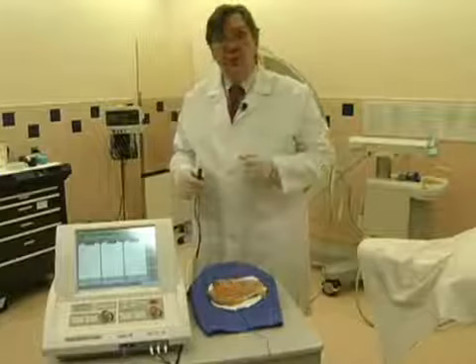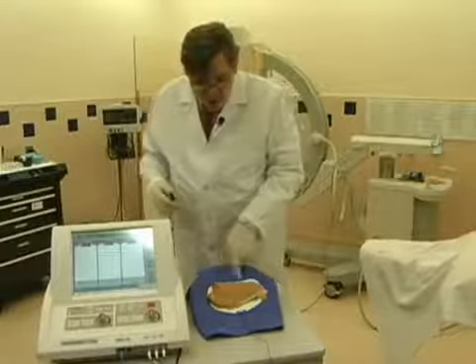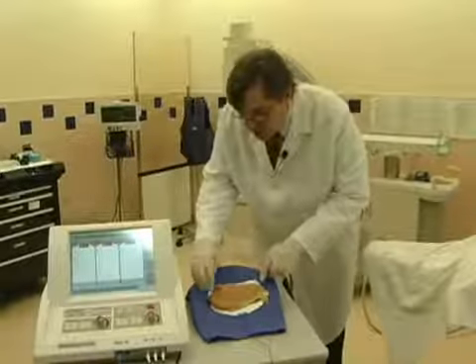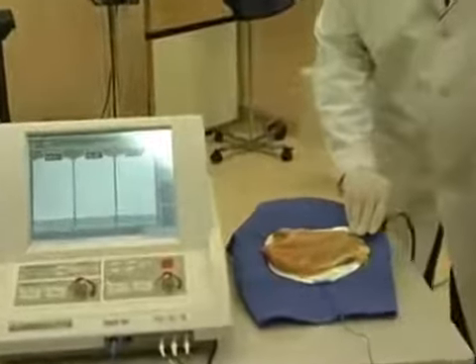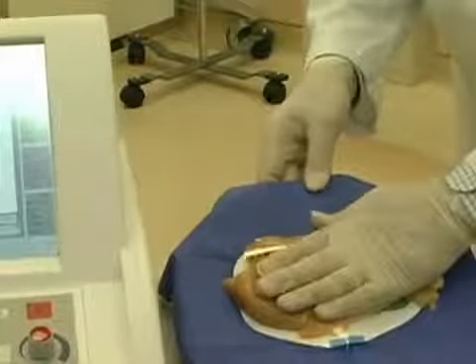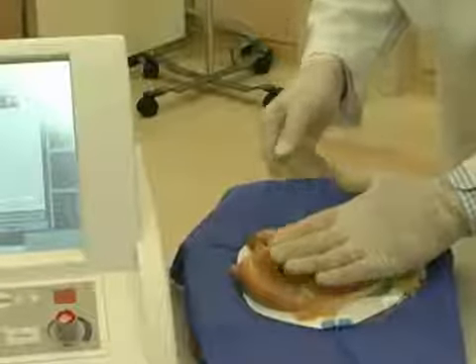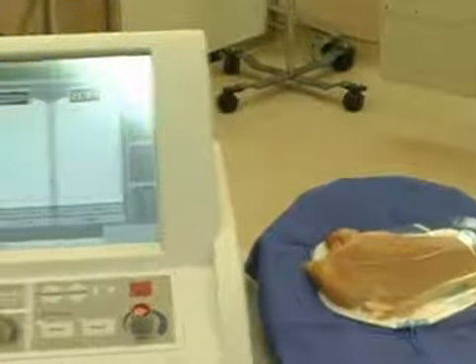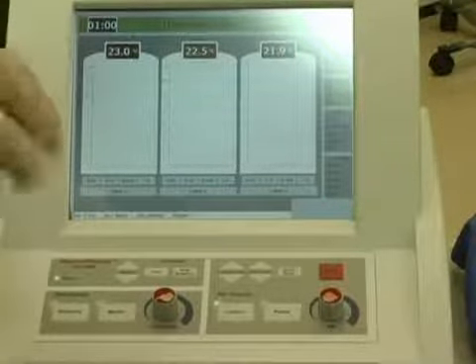Here I have an electrosurgical grounding pad, which you need for any type of RF procedure and is typically placed on the patient's calf. On this, I've placed a piece of chicken onto which I will place the Simplicity probe. In order for us to be able to actually visualize the ablation happening, I'm going to place this piece of plastic, which will act as a window during the ablation process. So now that I have my simulation completely set up, it's really very easy to operate the Simplicity system.